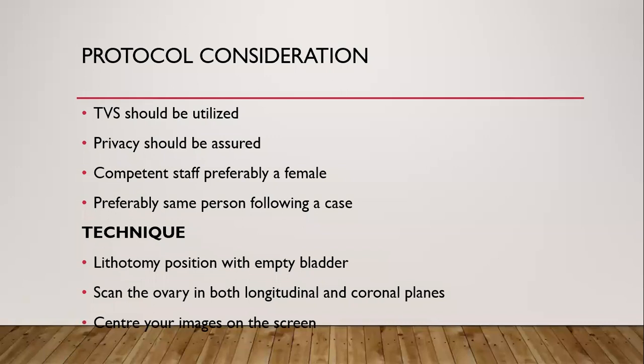As I get to follow this patient. However, if you are not able to do that, well and good, just have the standards that outline the procedure, and everyone that gets to scan these mothers will be able to follow the same procedure. The technique, much of this we know: our patient will have to empty the bladder, and they will equally need to lie on their back with flexed legs, of course, their feet stepping on the bed.